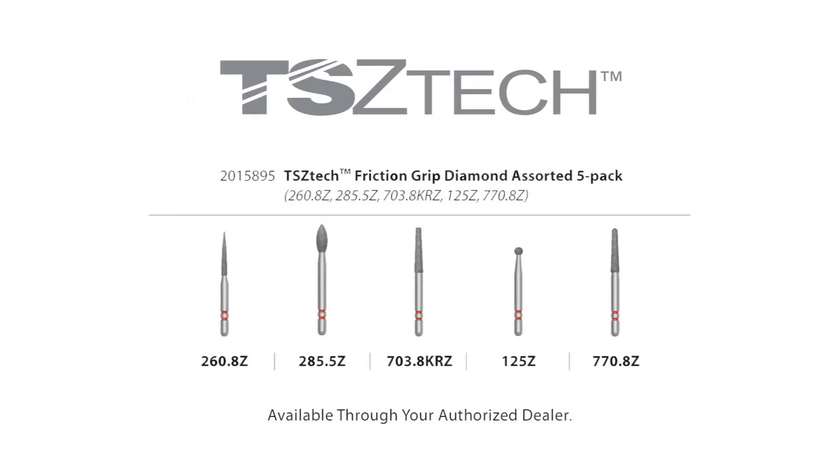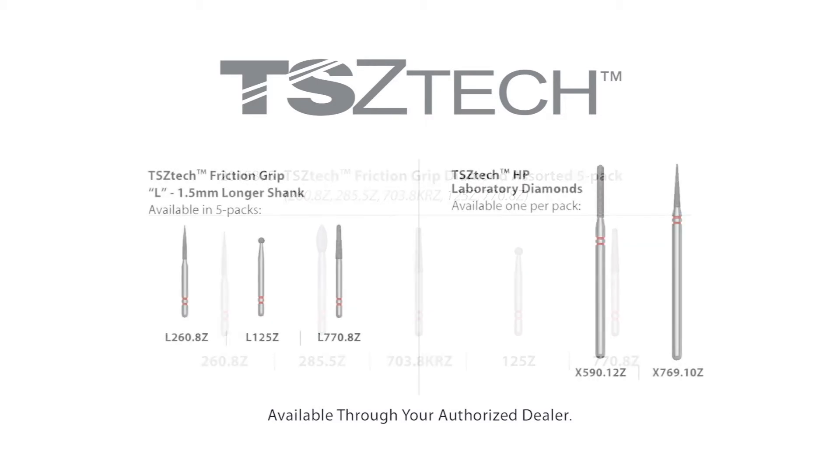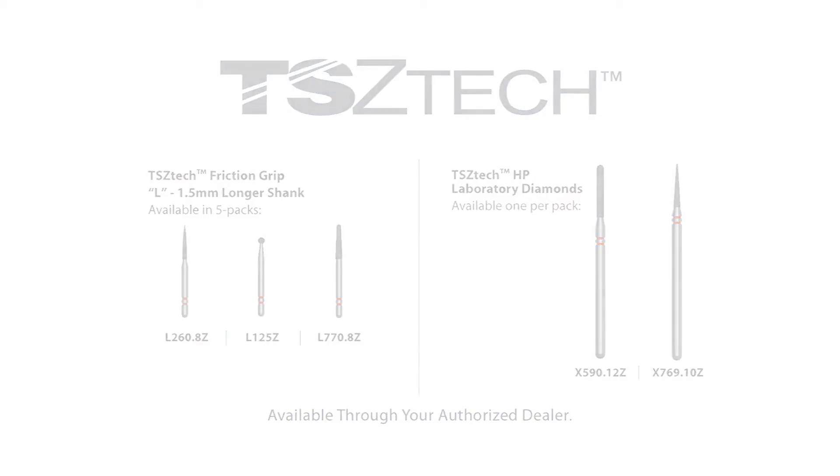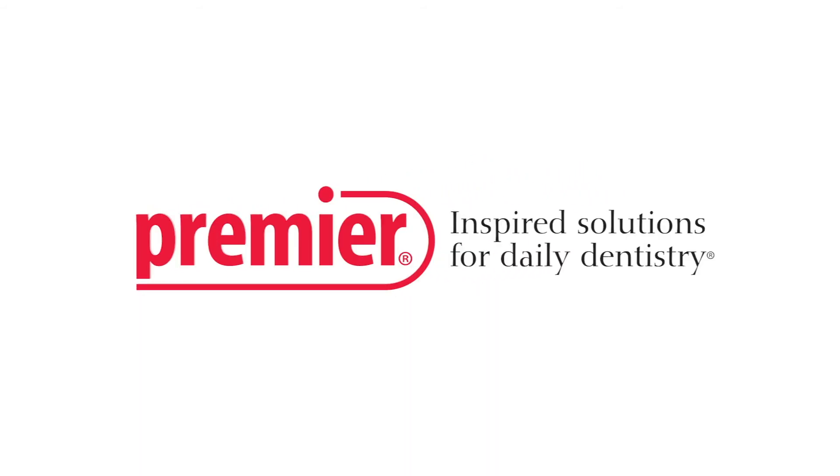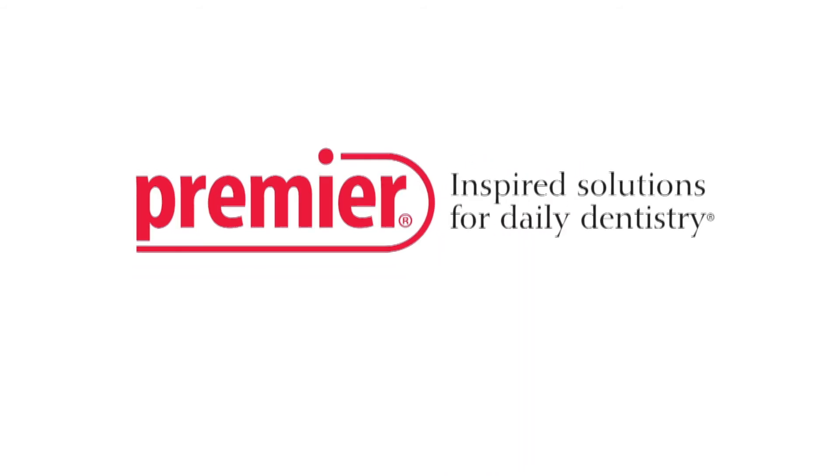Two Striper TS Zetac Diamonds distributed by Premier help dentists to remove all ceramic restorations efficiently and predictably, while also providing an effective tool to adjust all ceramic restorations and create endodontic access. Premier Dental: inspired solutions for daily dentistry.